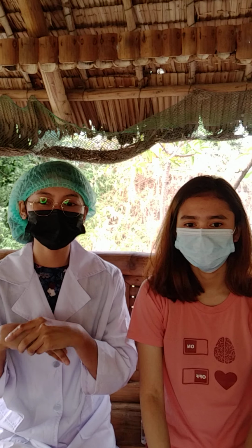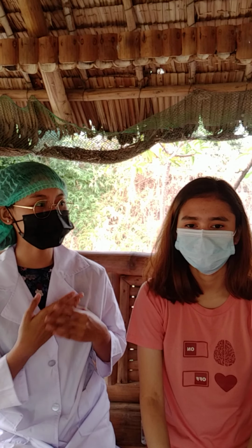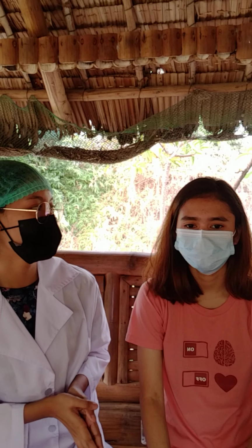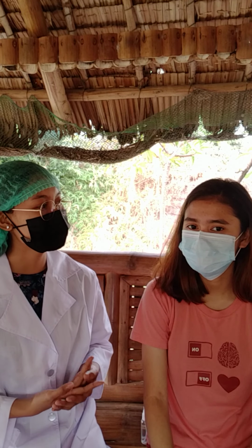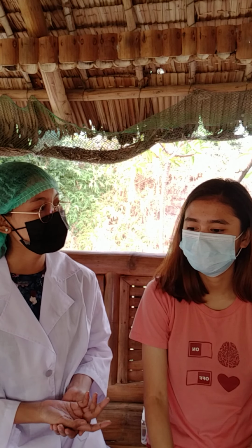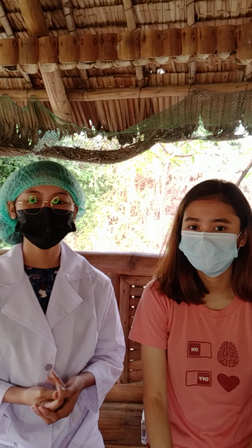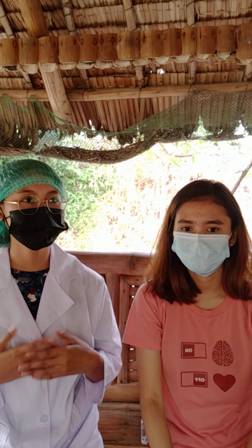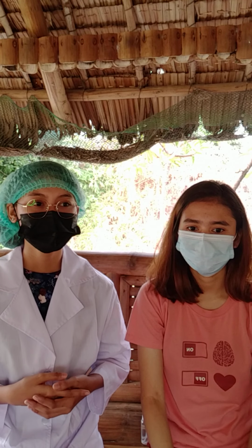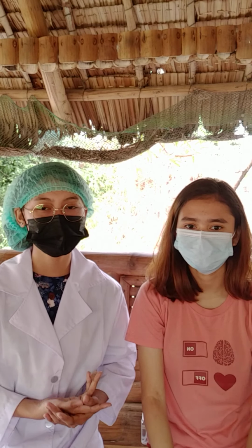And then after that, introduce yourself to your client and verify the client's identity. So, hello po ma'am, I'm Arlene Brun. I'm your nurse today from Tarlac State University. May I know your name po? Lisa Cable. And then after that, close the curtains and provide the client privacy to avoid any kinds of problem.